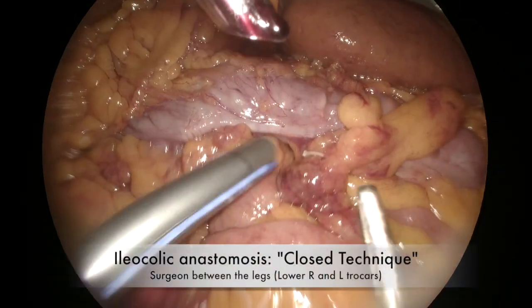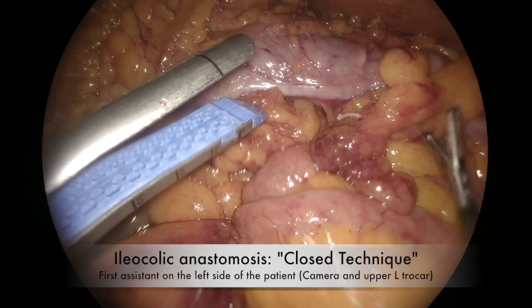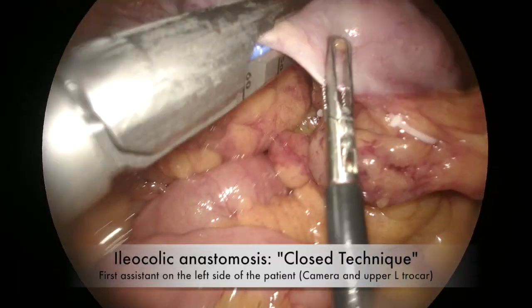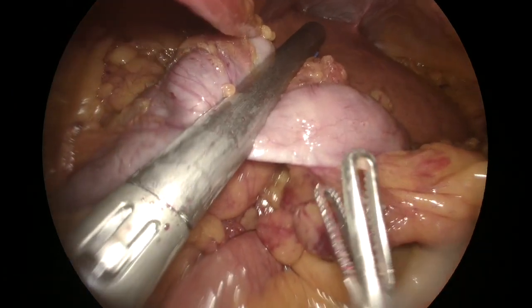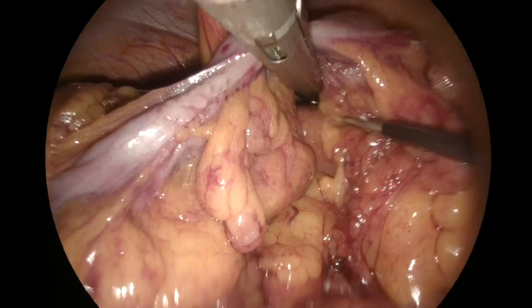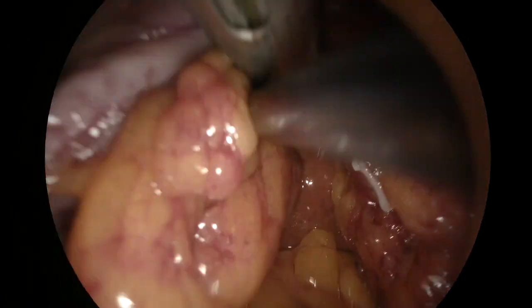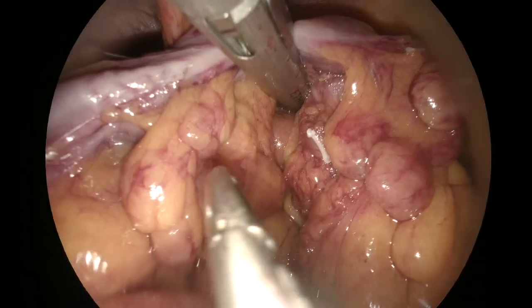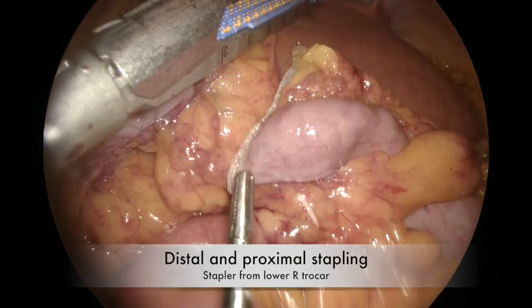Once the distal and proximal margins were dissected, two options are available. The anastomosis can be performed after the specimen removal. In this case, the colon and the terminal ileum were transected with the 60 mm linear stapler introduced via the right lower trocar, with the surgeon between the legs. The right hemicolectomy was so completed.